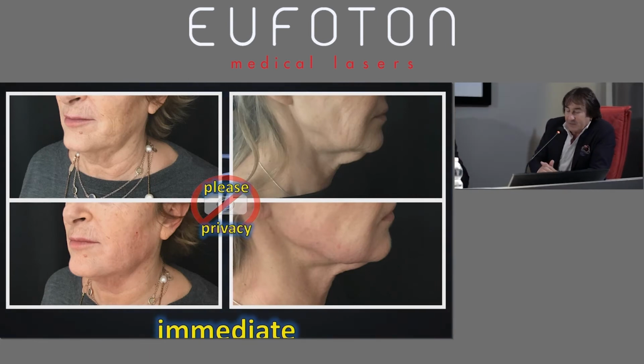As we already saw earlier on, we have a lot of problems. For many of you, being aesthetic doctors, you have to use the Endolift for giving a more complete treatment. Also thinking of emptying, filling, and traction threads. So we have to include other techniques with this Endolift technique to get better results. Or the platysma botulinum toxin. When to use Endolift in a more complex protocol, I think that's really interesting.